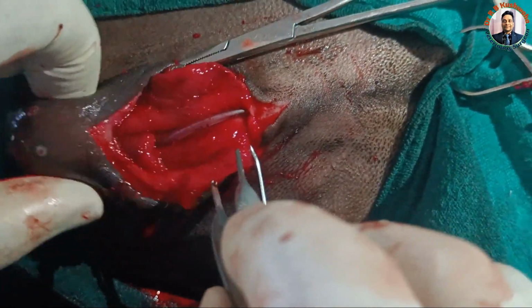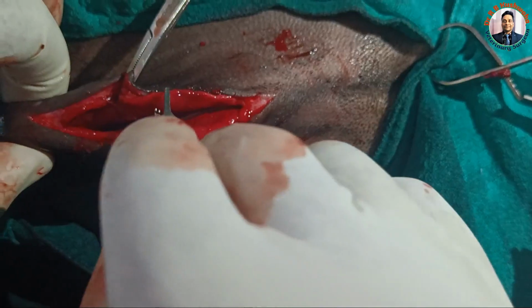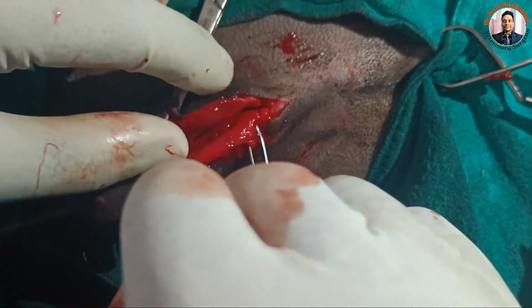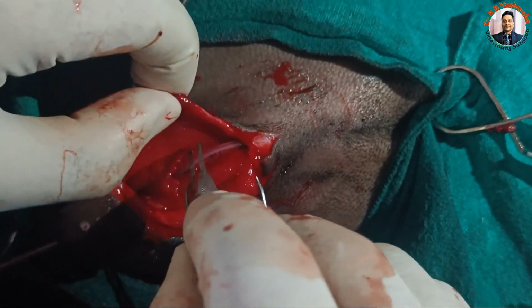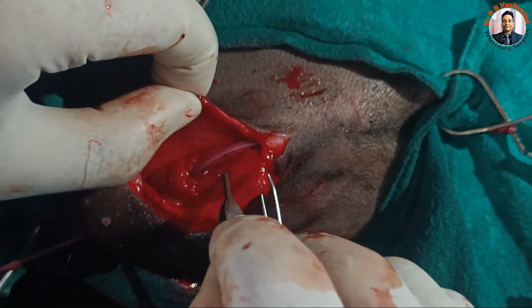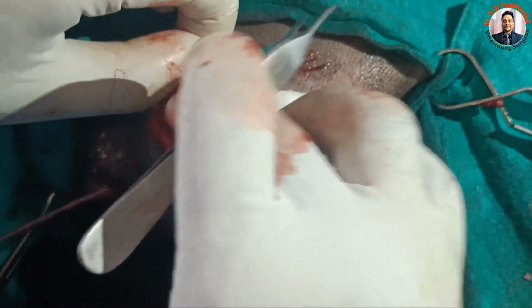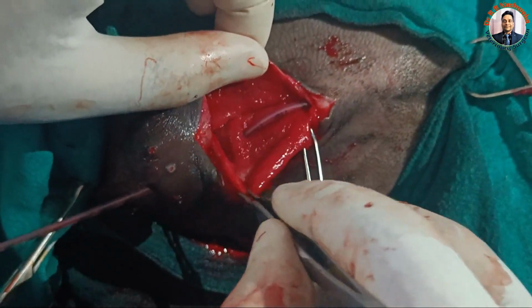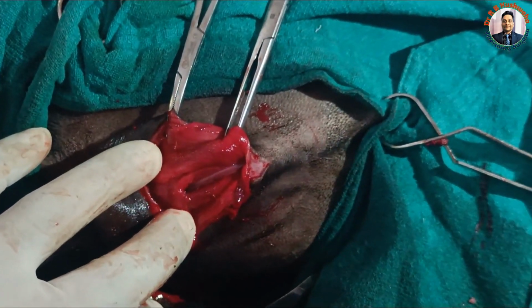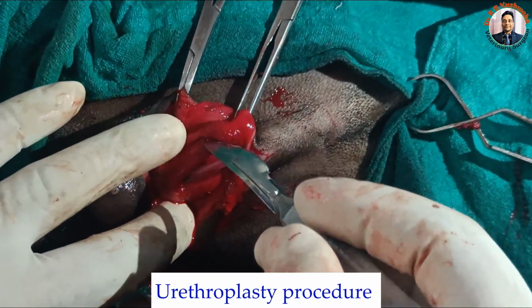Now you could see, this lumen is like this and like this. Earlier, the lumen was this much. Now we have converted this lumen into a narrow one. We removed this much strip and only made an incision, so that this urethra and this urethra will unite just over this catheter to make a narrow lumen, as in the case of the normal urethral lumen. This is a very important step. This is a bit difficult procedure, because this is a plastic type of surgery.